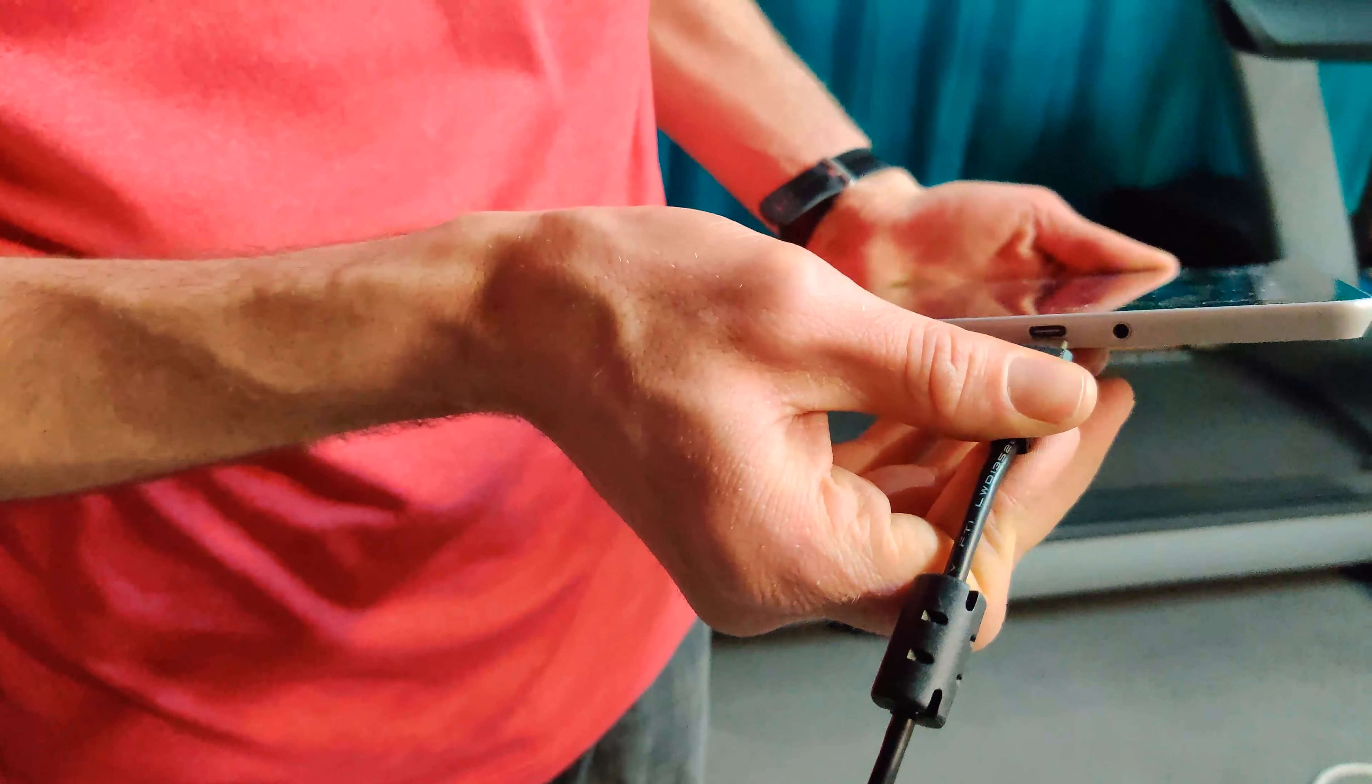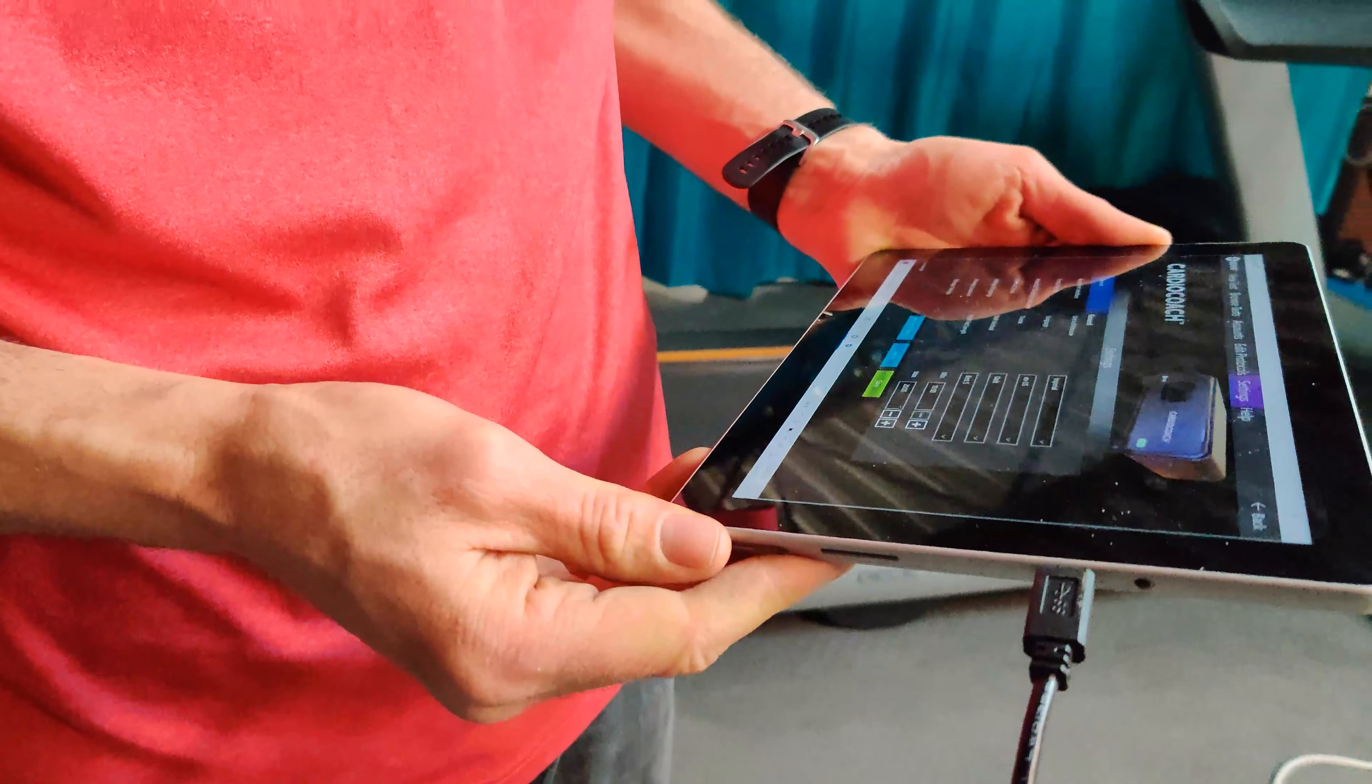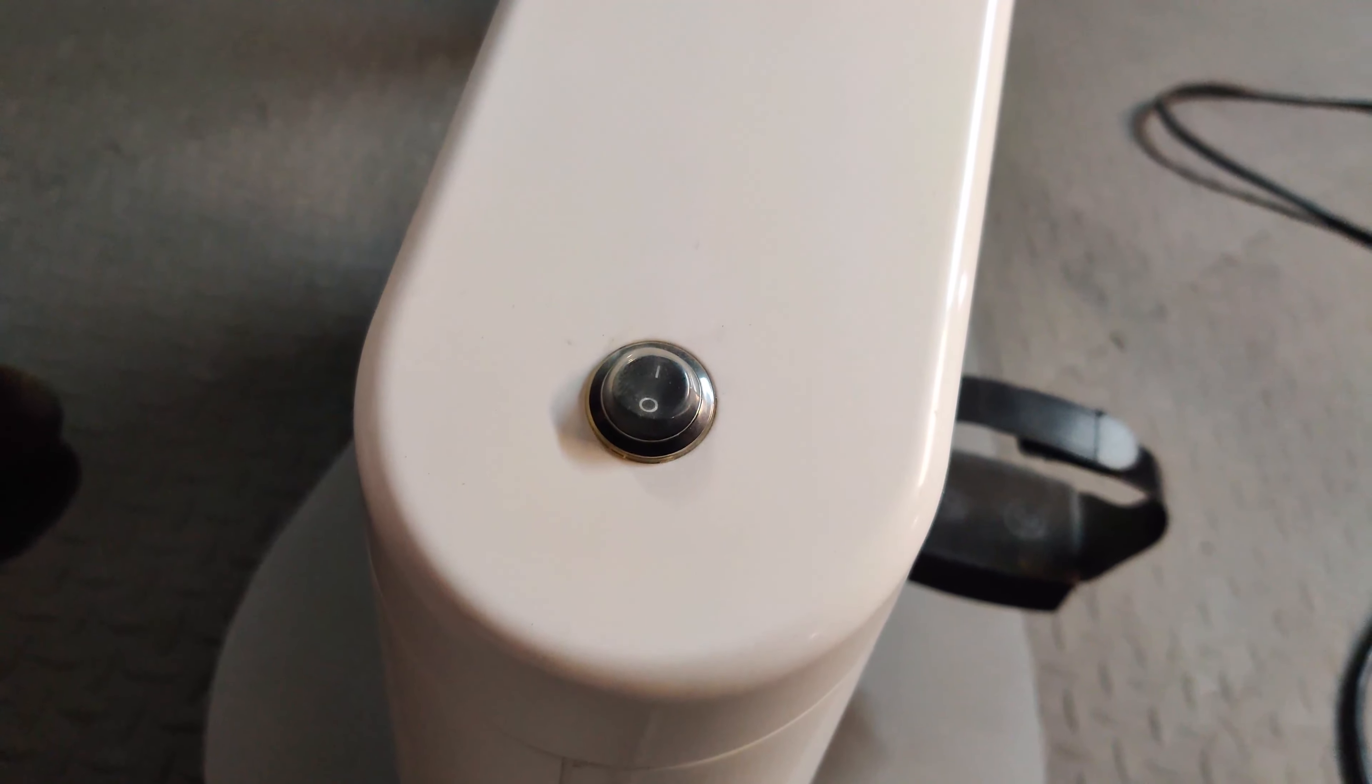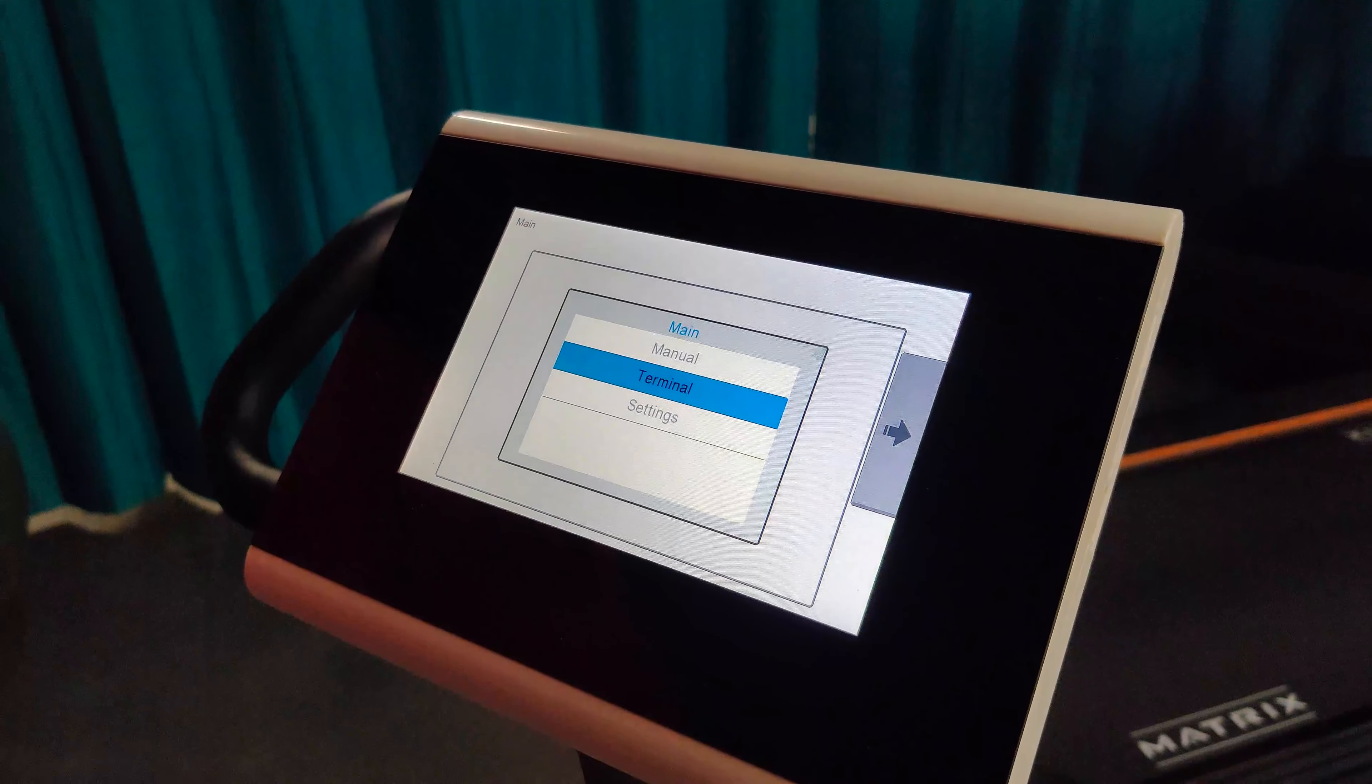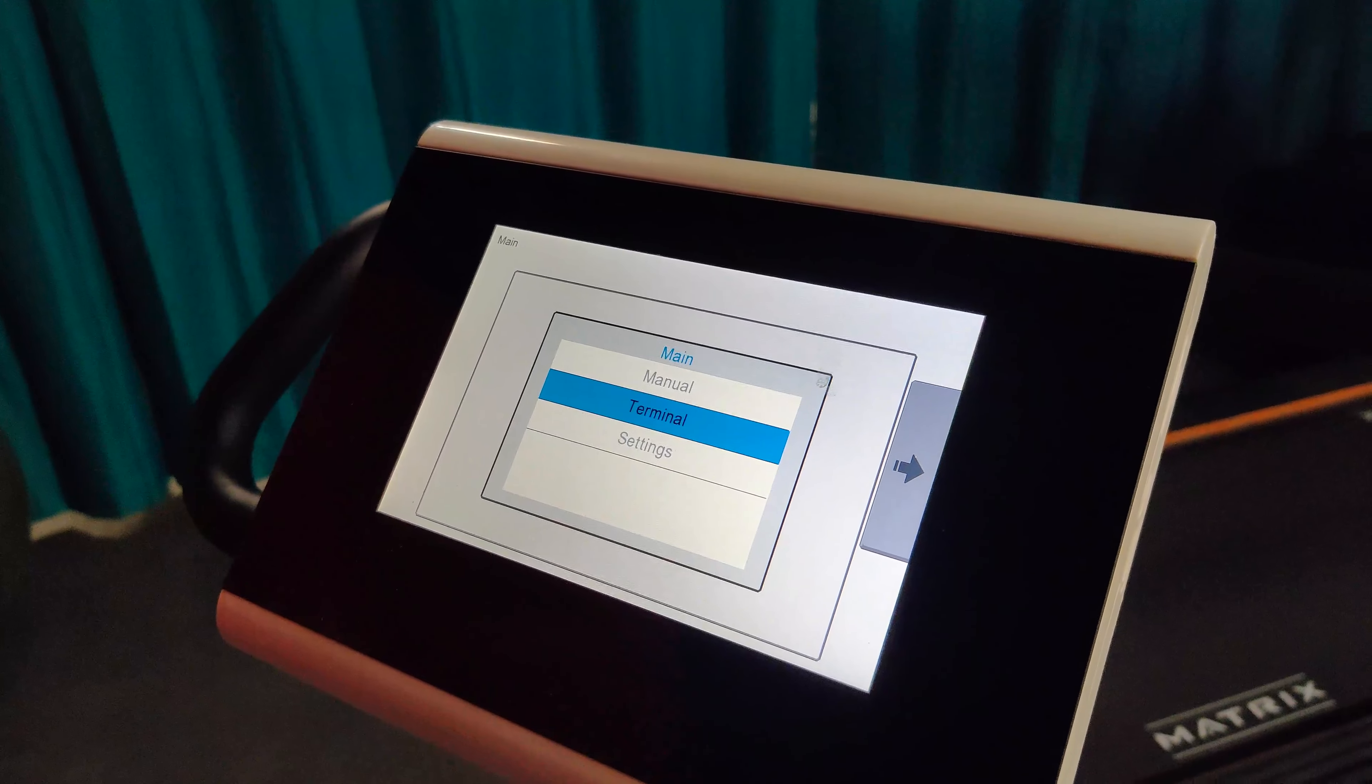To connect your load ergometer to your CardioCoach software, begin by powering up the load ergometer. Use your full hand to swipe across the screen from right to left to pull up the menu.